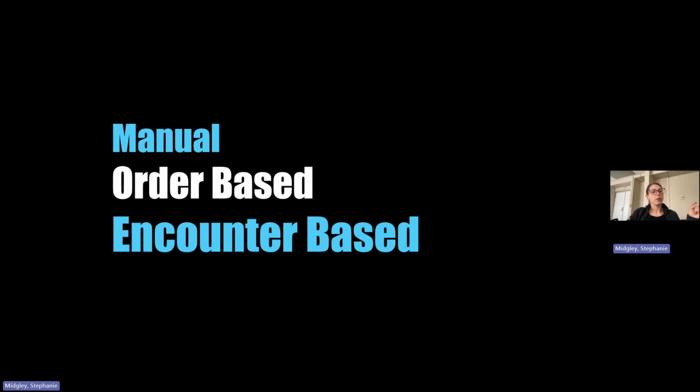Ideally, for emergency medicine, encounter based is the best way because it's basically everybody that's registered in the ED, and then you go through the registration list, find their name, and activate it. So you don't need an order. Yep, that's encounter based. It may work with Epic, but with Cerner and Butterfly, they could not get encounter based to work. So if you have a middleware, you've got to talk with your IT people to see if this is an option, because that's what held up our deployment of Butterfly here. We tried for 2 years to get the encounter based workflow to work, and it didn't.